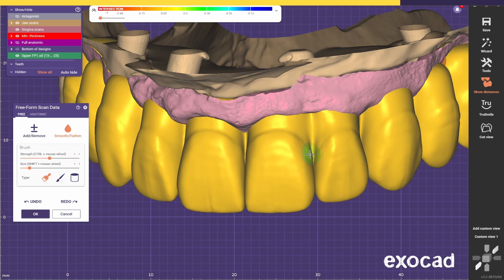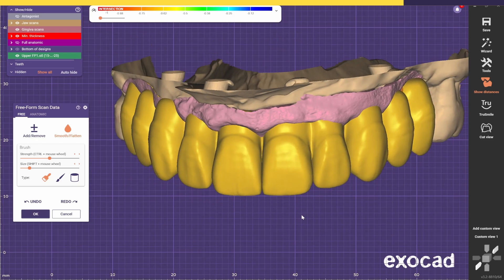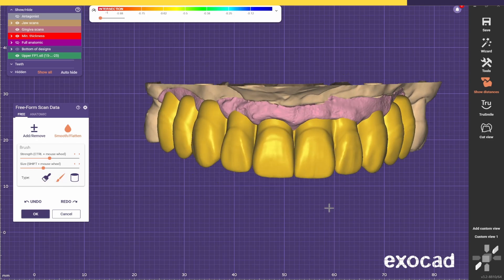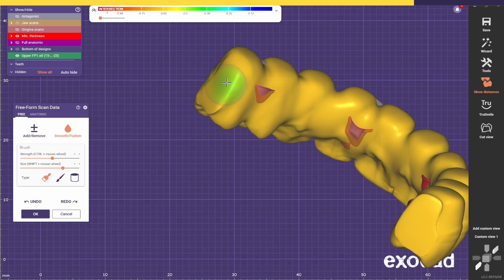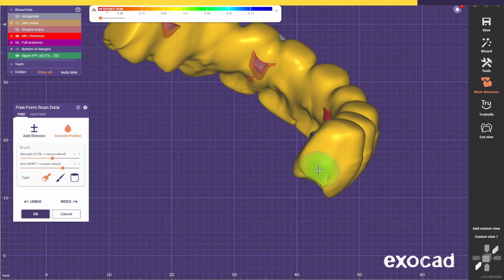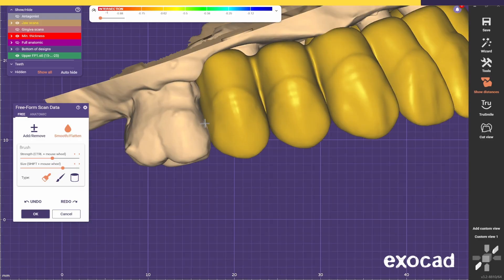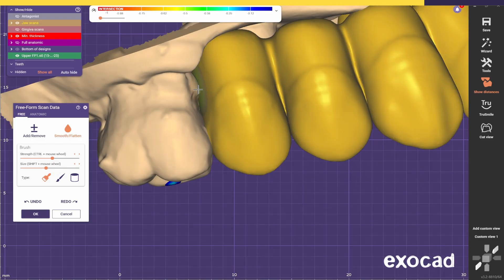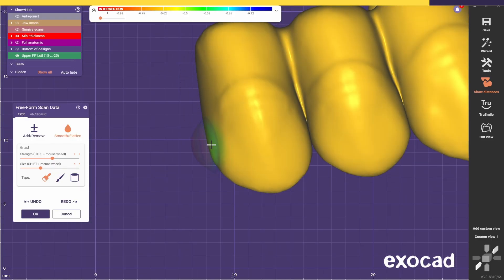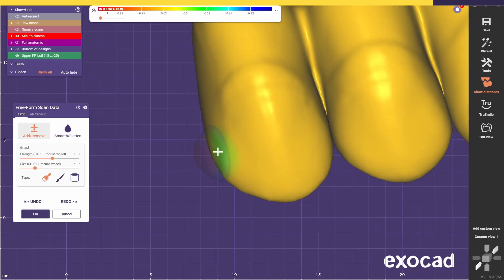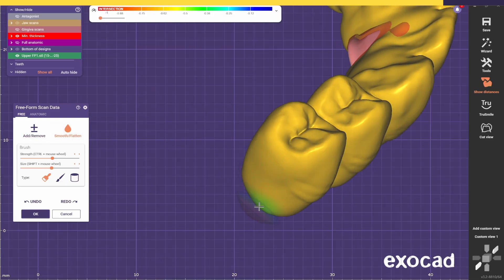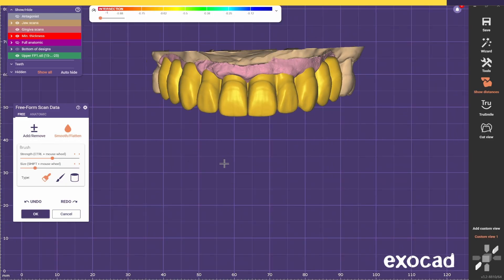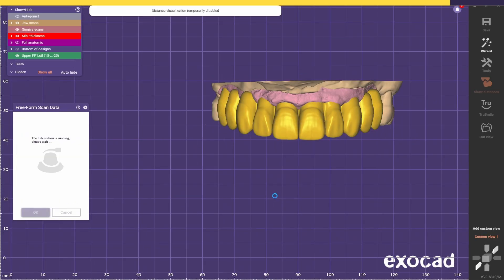Now we can sort out the distal parts of the bridge. Because we cut off the molars and then closed the holes, you're going to have this geometry on the distal. Just make sure it looks nice and you create a nice contact on the distal — just like this. It's looking nice. Press OK.